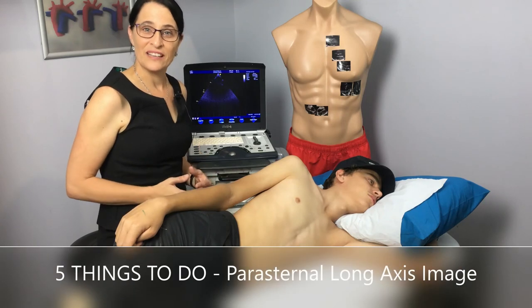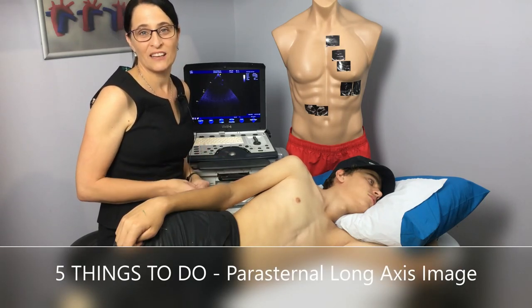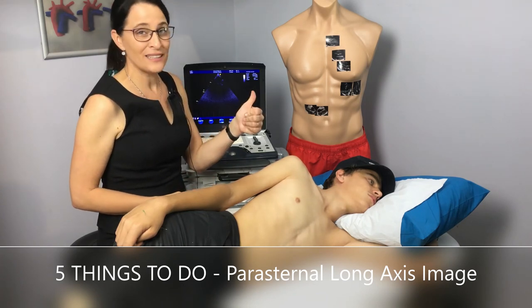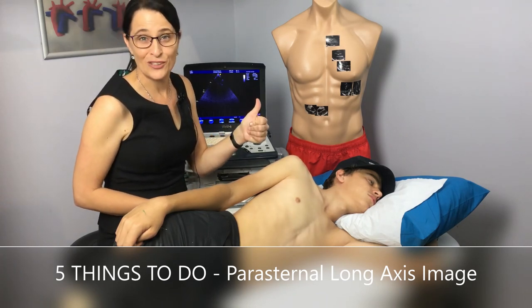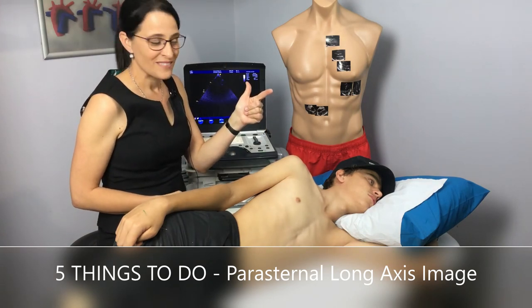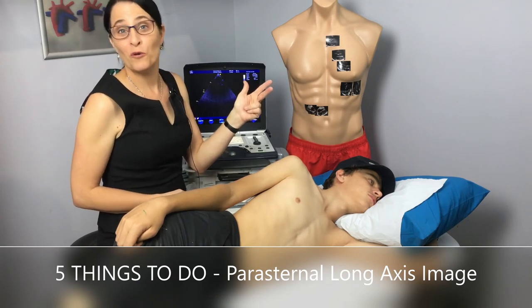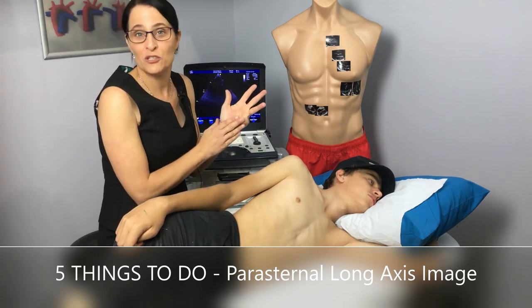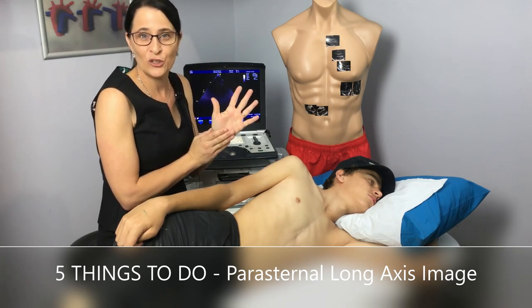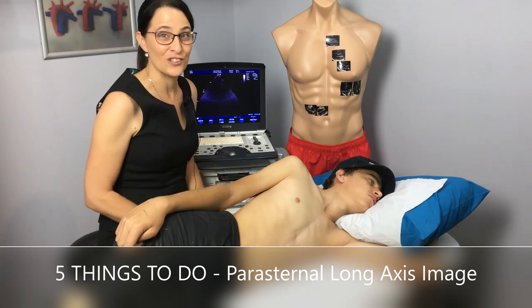In summary, these five tricks of the trade will assist you in obtaining a good parasternal long axis image. Number one: big circles. Number two: a black and white picture. Number three: find the aortic valve. Number four: recheck your image marker. And number five: if needed, clockwise turn to open out the ascending aorta. Now it's your turn.